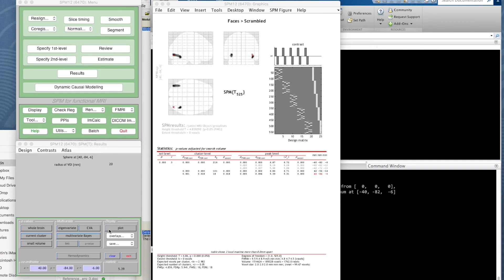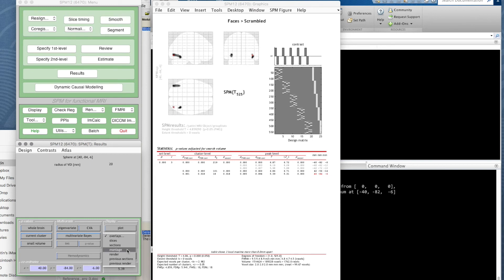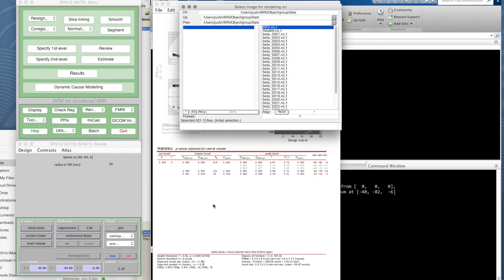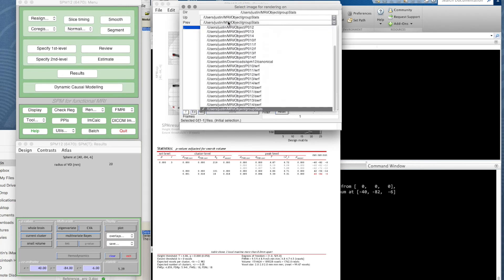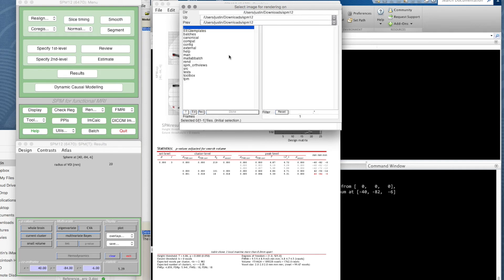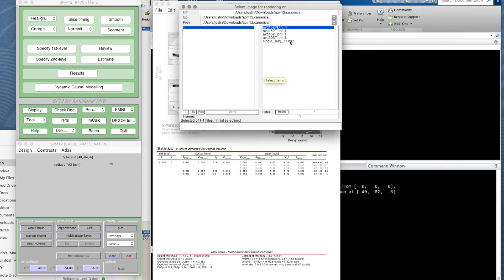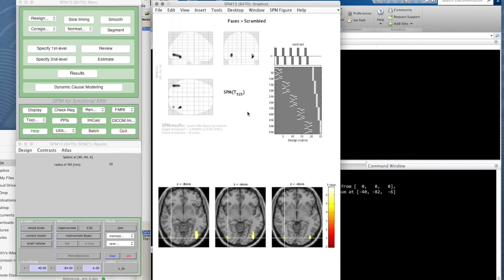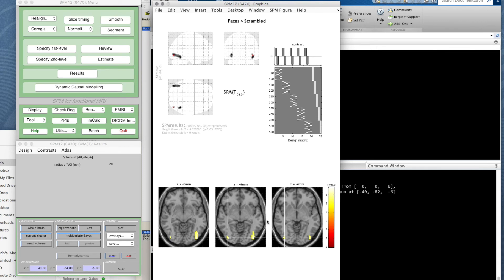It would be nice to look at it in more detail, perhaps visualize it a bit better than on this summary glass brain. If you look at the display panel in this figure, you see it says we have the option to use overlays. On this menu list it says slices, sections, montage, render. This data has all been normalized into standard space, so if we wanted, we could use a canonical image.